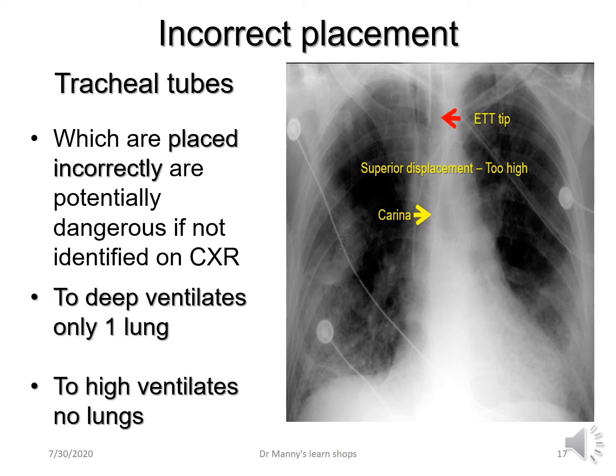Here's an endotracheal tube tip that's too high. And because it's too high, you're not going to be ventilating the patient correctly. Or, if it's too high, there's the potential that the tube can be displaced above the cords, the vocal cords, and result in failure to ventilate. Or it could be easily dislodged, extubation.